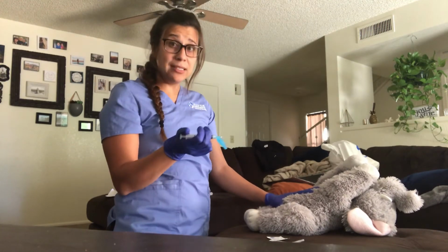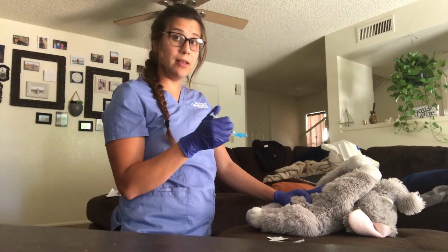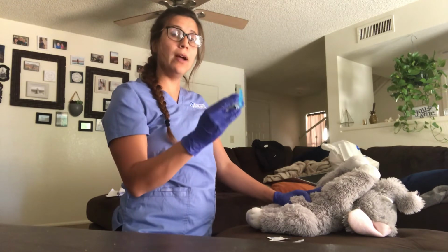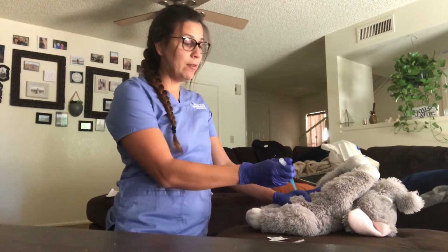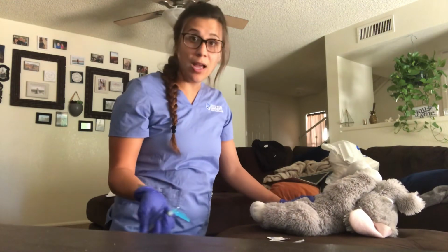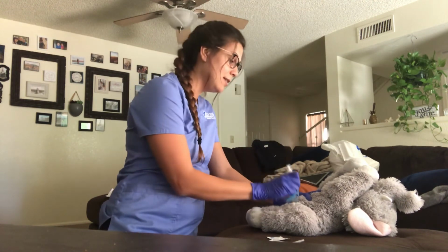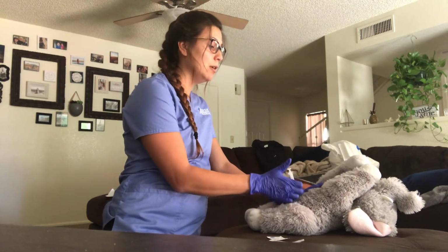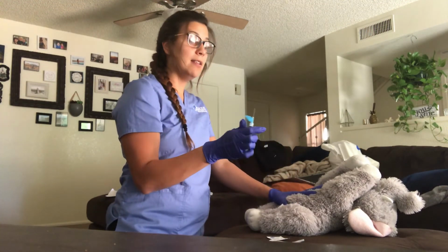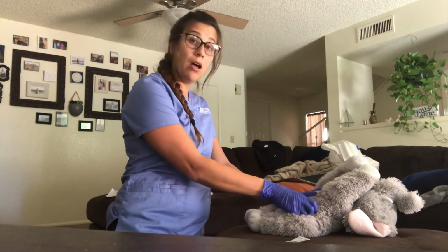If the patient's obese, you want to make that fold by pinching the muscle, but you would actually go in at a 45-degree angle, right below that fold. So 45-degree angle and over. For this instance, it's a normal patient, they're not obese, and we're not giving heparin. We're just going to stick, let go of that fold, inject the medicine in, and take it out. Safety, always safety your needle. Once you safety, you'll put the gauze on.